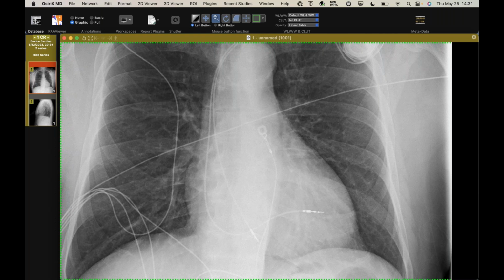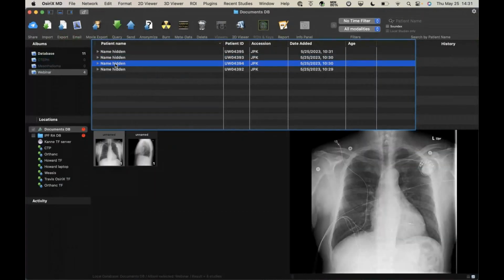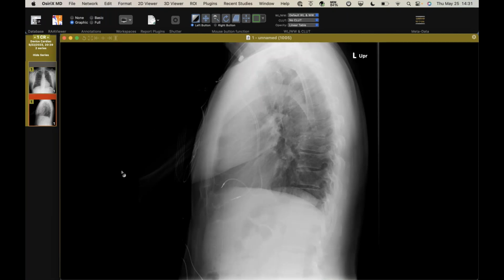Do they typically keep the patient overnight as well at your place and then radiograph the next day? Yes, they keep them overnight. And then sometimes they get a portable in the PACU, depending on how heavy the sedation was, and they get a 2-view, PA and lateral. On the lateral projection, are the patient's arms down? I'm just curious.